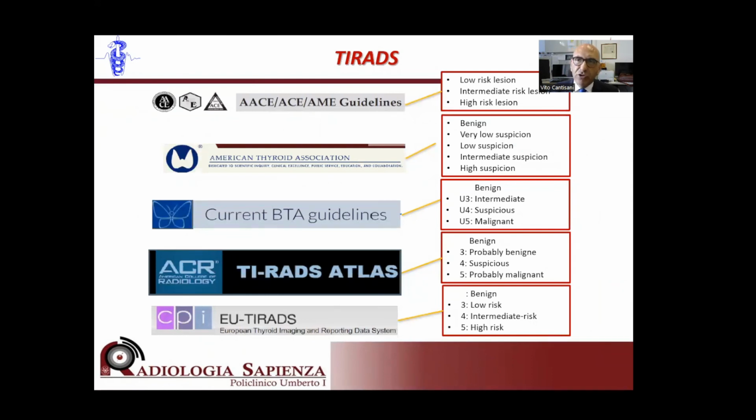Horvat and other colleagues proposed to put together single ultrasound features in order to grade and to stratify the malignancy risk of these nodules.